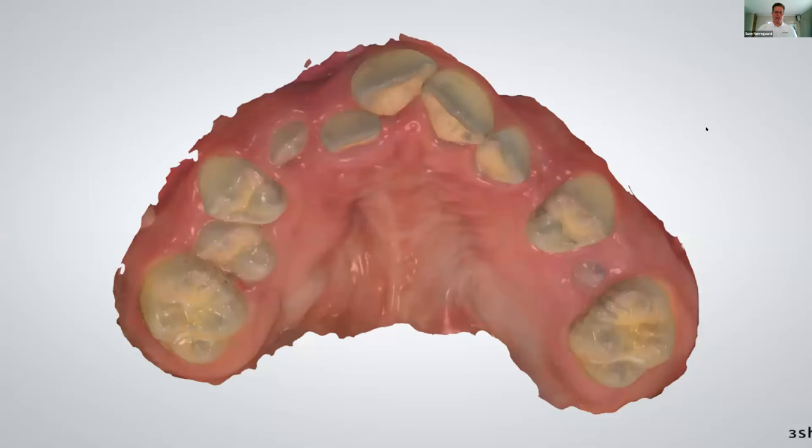So crowding, why can crowding be a challenge sometimes? Well, if you see at the image here, you can see the two incisors are actually lying on top of each other, and they are sharing bits of data, both of them, and to capture the details in between them, you really need a good intraoral scanner that is able to quickly capture the data so that you can maneuver the scanner around in the mouth without being too stressed. The scanner shouldn't be stopping while it's scanning, and the scanner should capture the fine details so that you can send it for production with high level products there.